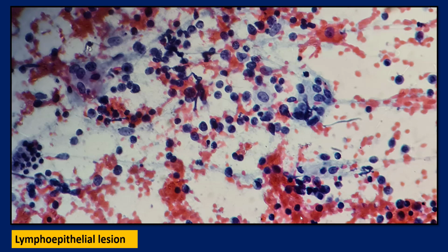This is a lymphoepithelial lesion. We are going to talk a little bit more about lymphoepithelial lesion in the next couple of slides. But in the lymphoepithelial lesion, what you find is a lymphoid cell proliferation, reactive cells, and then you are going to start seeing these clusters of ductal cells with an infiltration by lymphocytes.